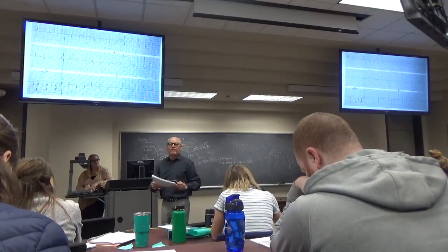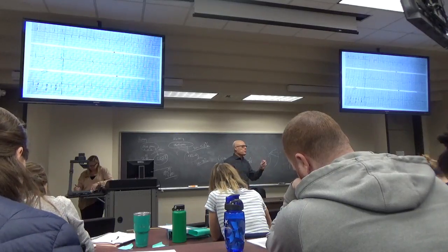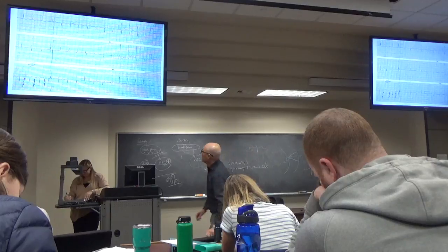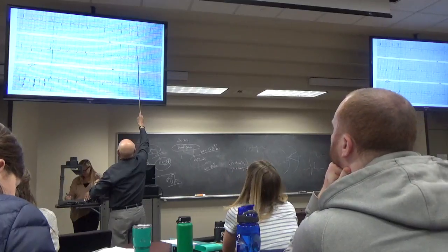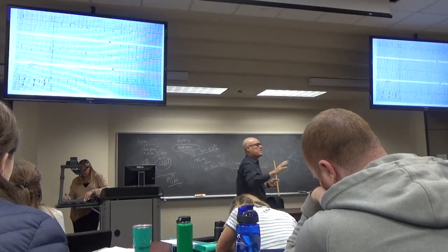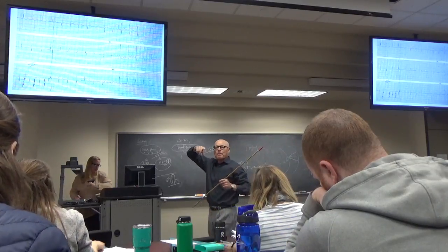what does V5 look like? LVH. It looks like an LVH. There's too much R wave there. I'm going to teach you a new trick that I didn't teach you before. If you add the R wave in V5, how many boxes it is there, to the S wave in V2, add them together. Estes doesn't do this. Estes says you need 35 millimeters, 35 boxes, in V5.